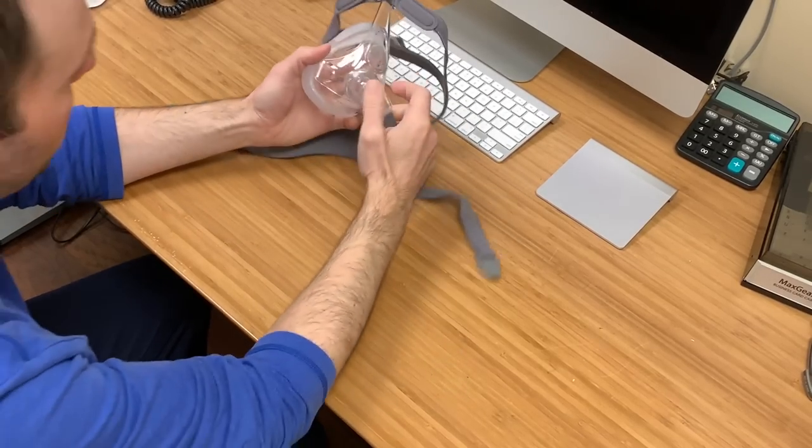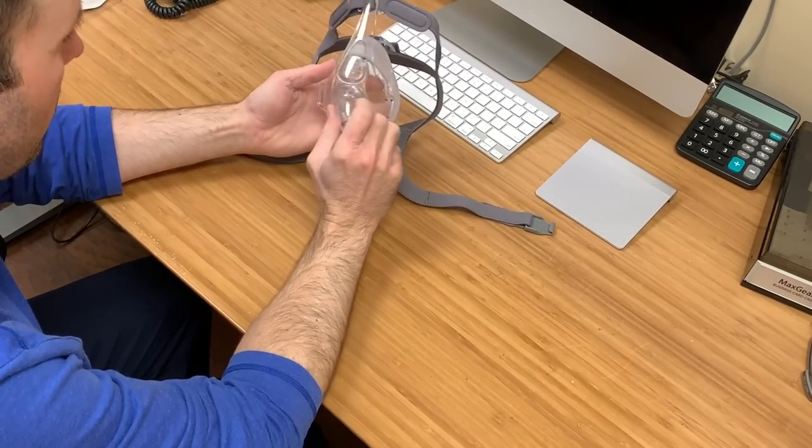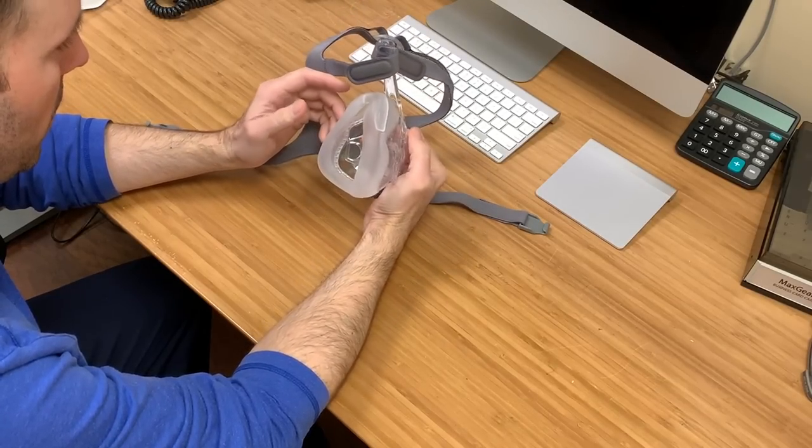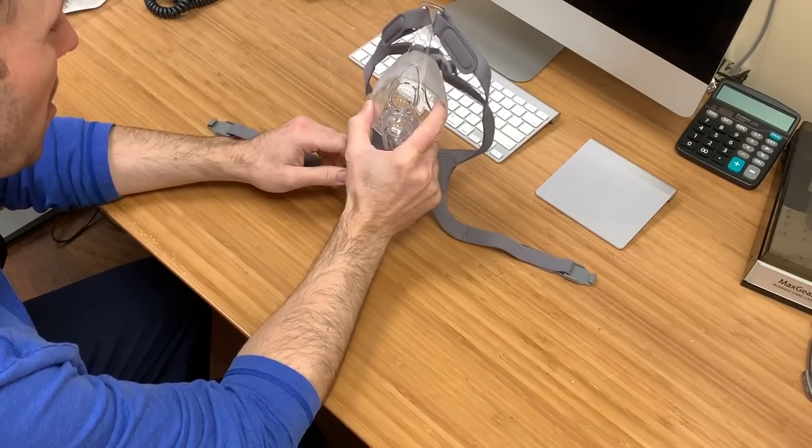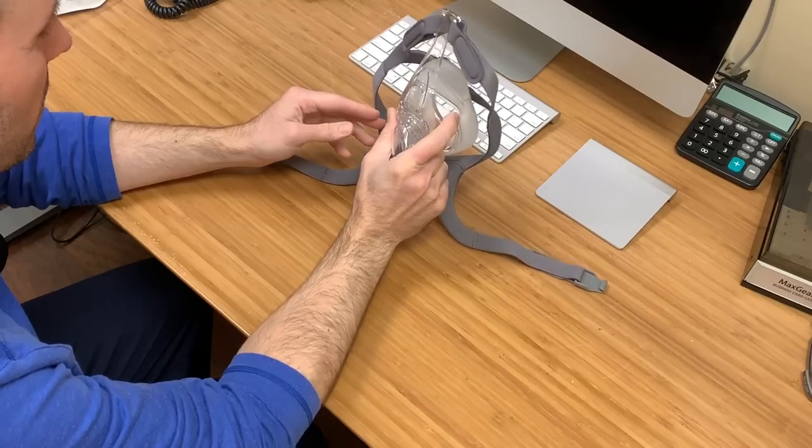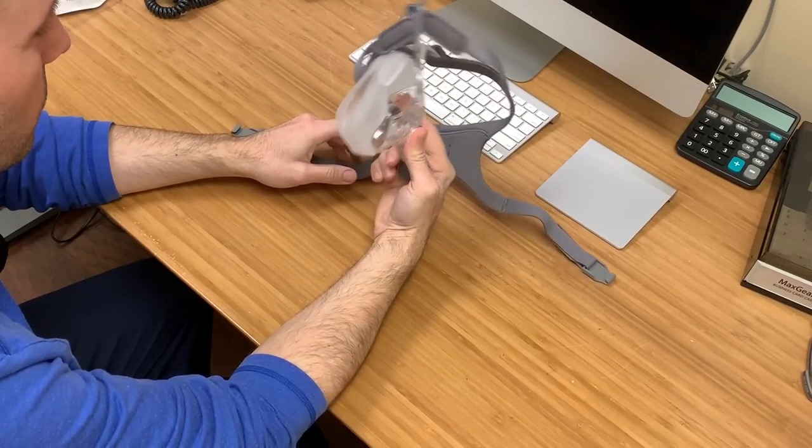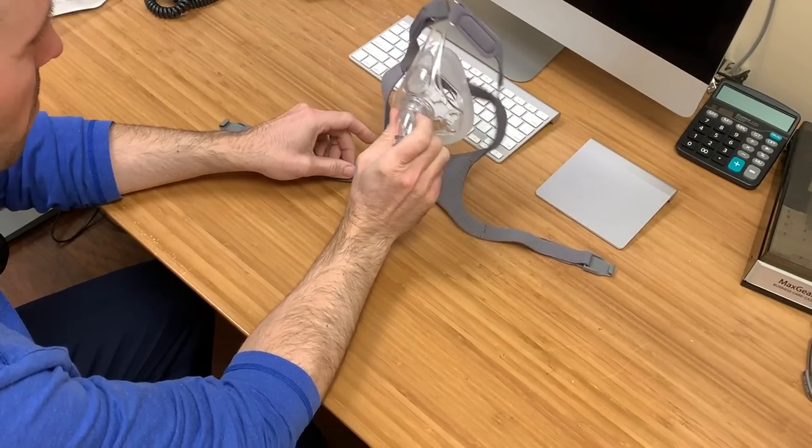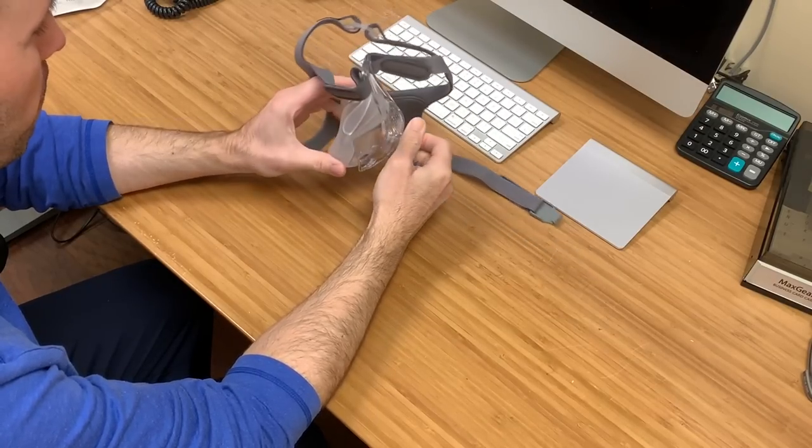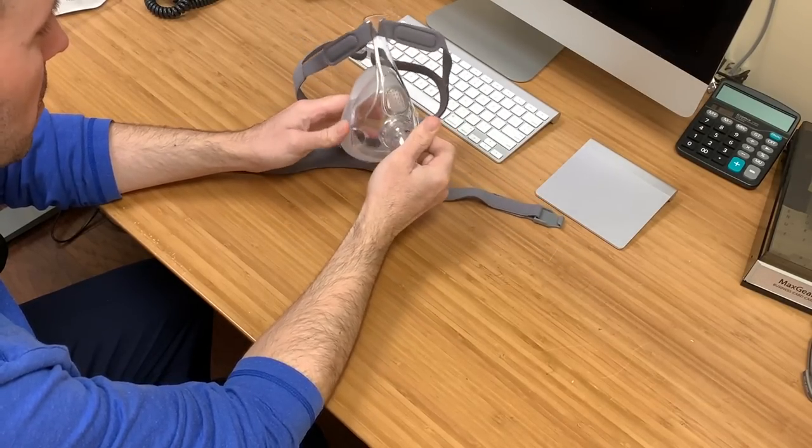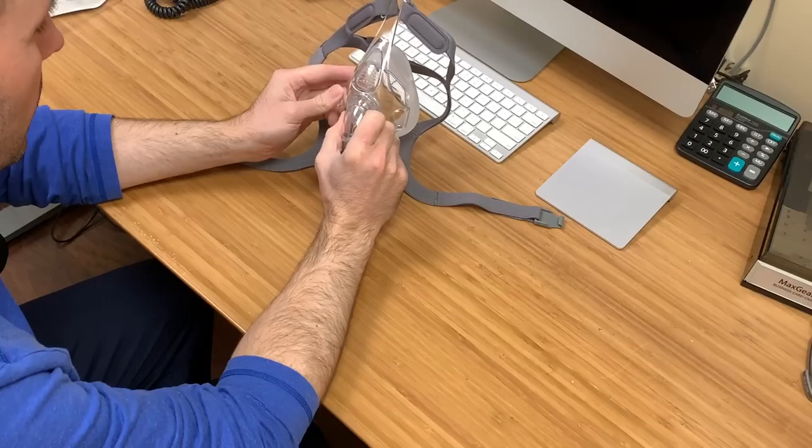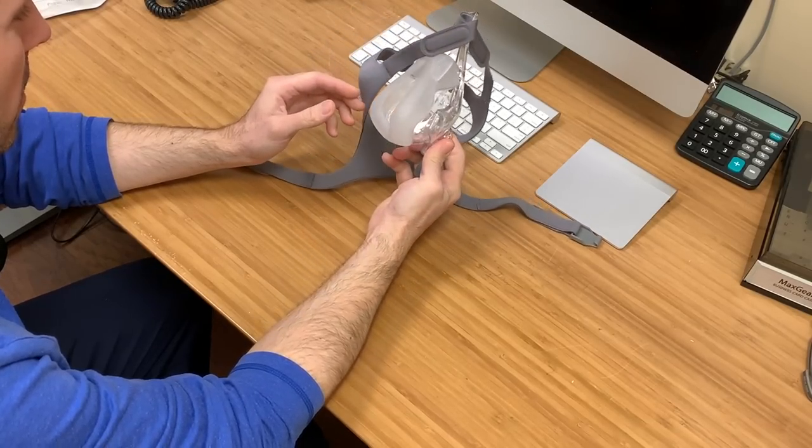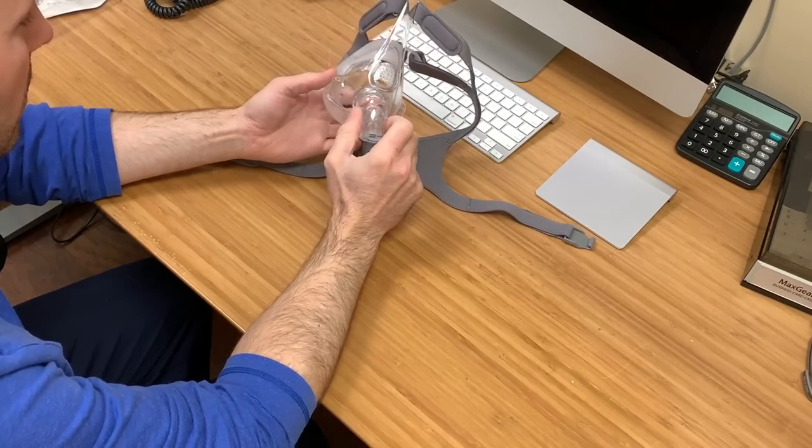So I have the Fisher & Paykel Simplest here and I've been using it for the last two weeks. To be honest with you, when I first saw this you're probably thinking this looks like something from 20 years ago. It looks barbaric and I was very skeptical going into this, and I was wrong. I was pleasantly surprised how great a mask this is.